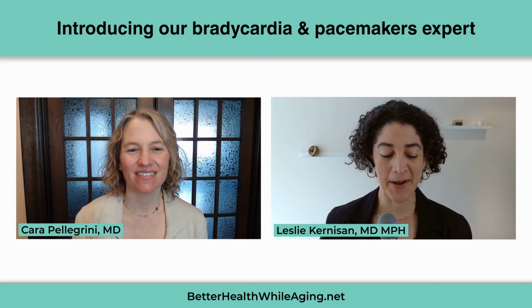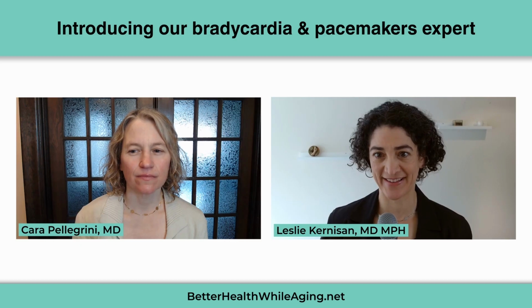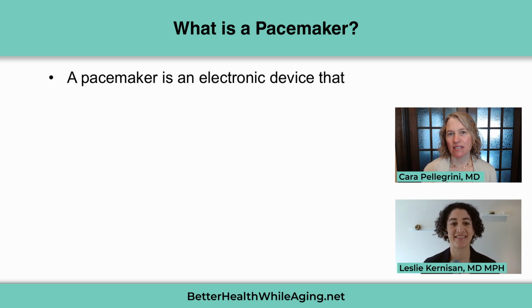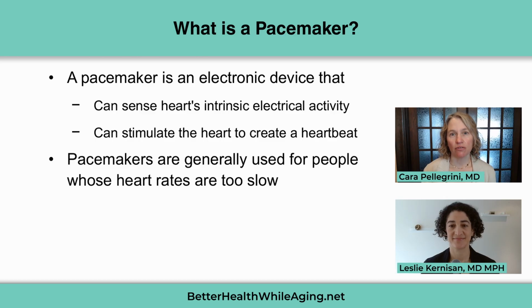Okay. So why don't we start by first talking a little bit about what is a pacemaker, and then maybe we can talk a little bit about slow heart rates. So let's start with a pacemaker. What is a pacemaker and why do we use them in medicine? Yeah, good question. So a pacemaker is an electronic device that is able to both sense the heart's intrinsic electrical activity, and then give a stimulus to the heart to create a heartbeat. And we use them generally for people whose heart rates are too slow.